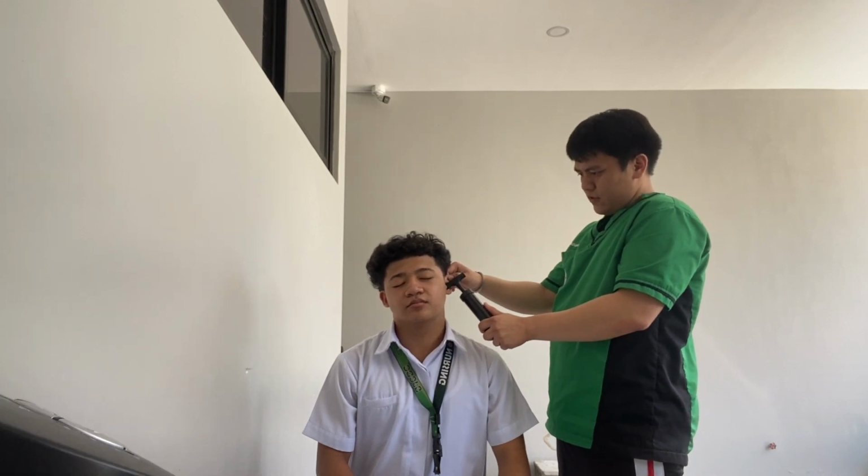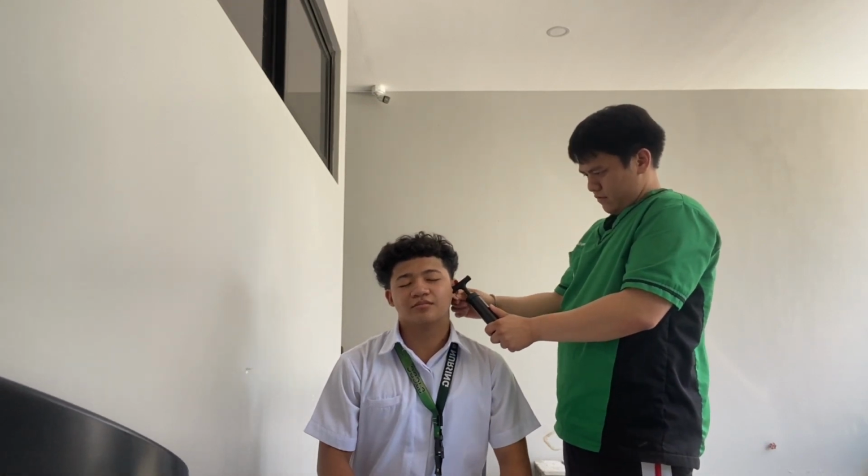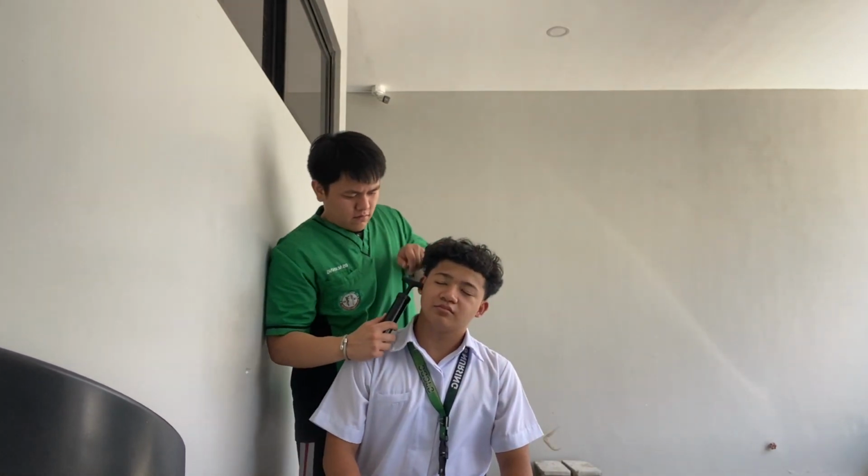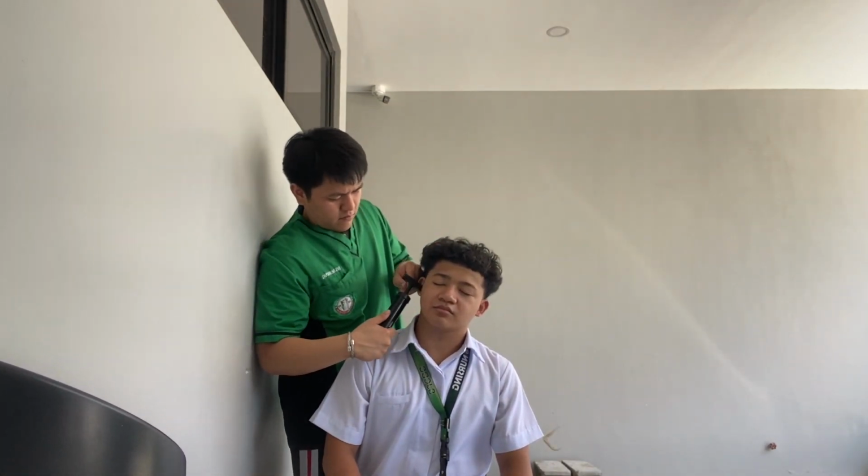Use an otoscope to check the ear. Check both sides, left and right. Alright. Good.